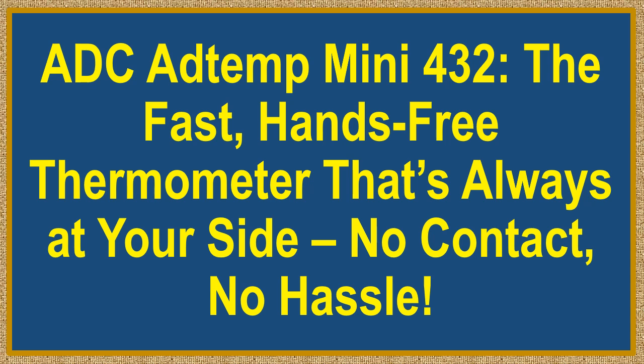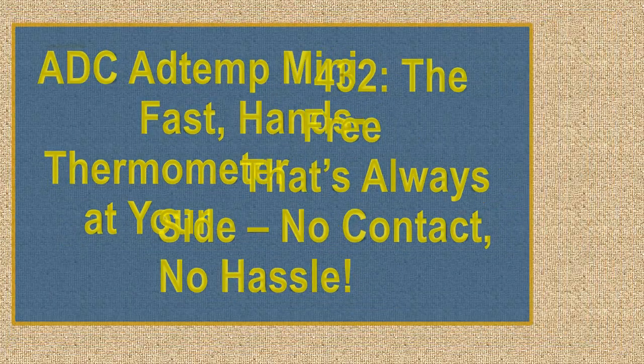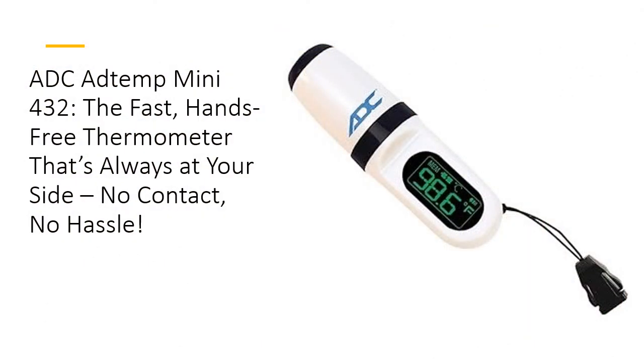ADC AddTemp Mini 432 — the fast, hands-free thermometer that's always at your side. No contact, no hassle. Meet the ADC AddTemp Mini 432, the tiny thermometer making a huge impact.